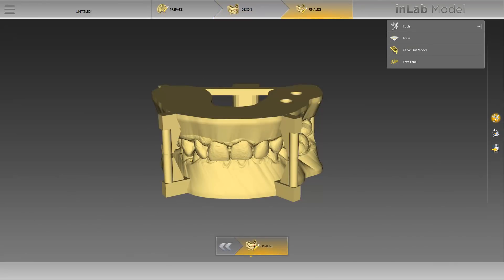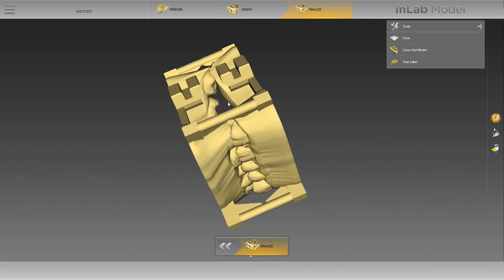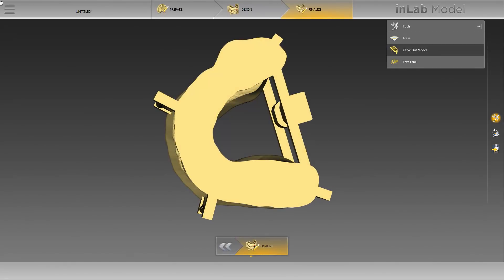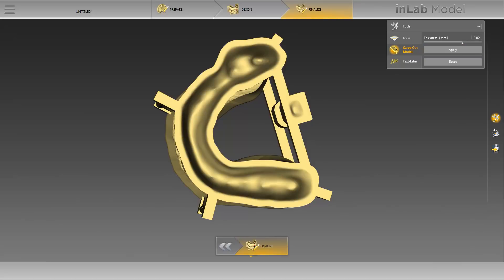The final calculation of our model has now been made, and you will again have various tools available in this phase. Using the form tool, you can apply, smooth, or remove material. We start with the option cave out model. This option is used to cave out the upper and lower jaw model. By moving the thickness slide controller, we can define the remaining wall thickness. In our case, a thickness of 3 mm is ideal. We will start the process by clicking on Apply. The upper and lower jaws are now caved out according to the defined thickness.